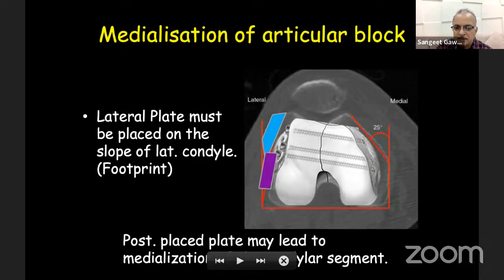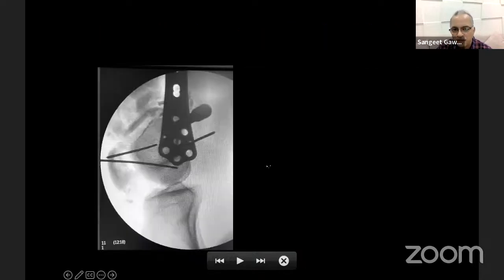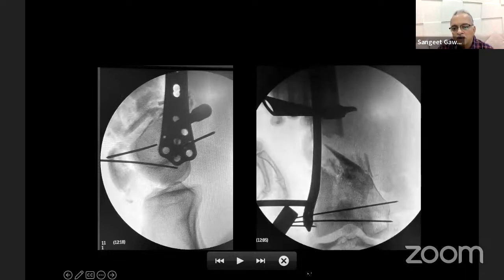Posteriorly placed plates may lead to a medialization of the condylar segment. So the violet area is the posterior placement of the plate, and that will give rise to a deformity. In a lateral view, it will appear like this, and in the AP view, it will appear like this. The entire condylar block has been shifted medially because your plate is not in the footprint.